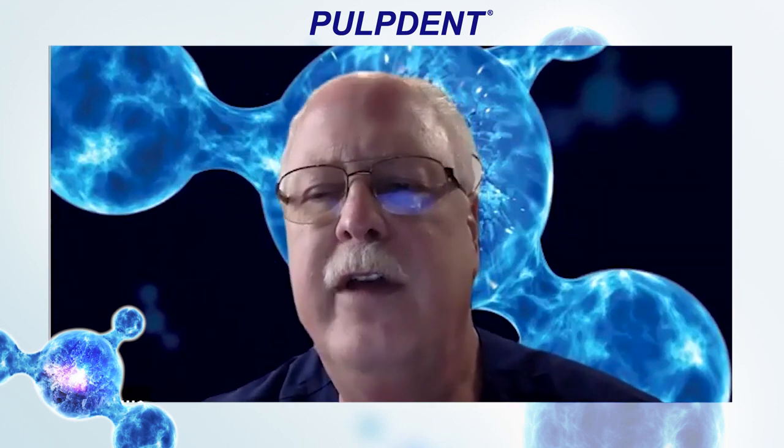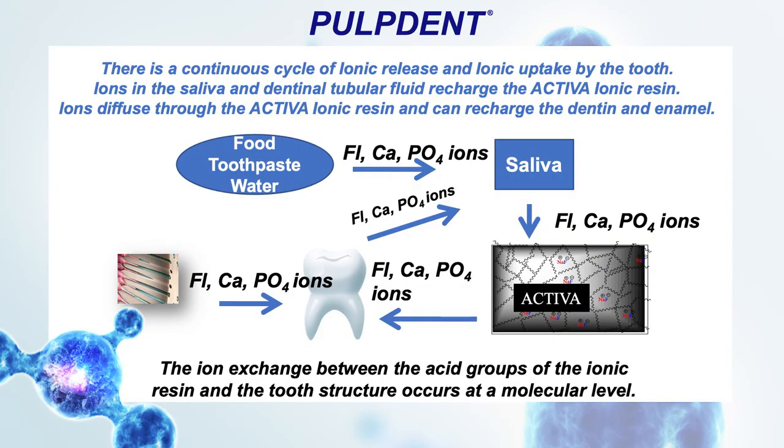I mean, my grandmother lost all of her teeth in her 30s and wore dentures for most of her life. Now, granted, we've made a lot of strides since then as far as restorative, but this is the next leap in that realm as far as having materials at our disposal that actually help provide the nutritive functions to the tooth of calcium and phosphate ions, which are the building blocks of apatite. Now, ACTIVA, I've described for many years as a battery or a storehouse for ions: fluoride, calcium, and phosphate.